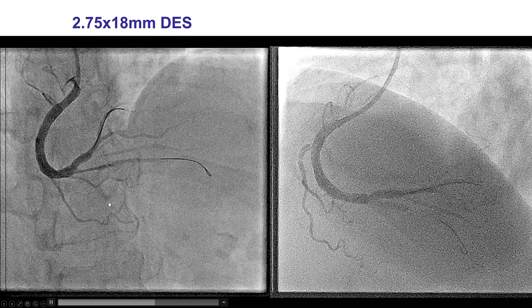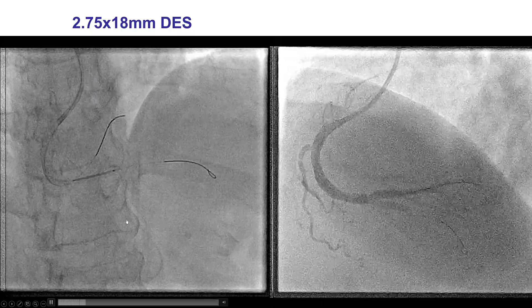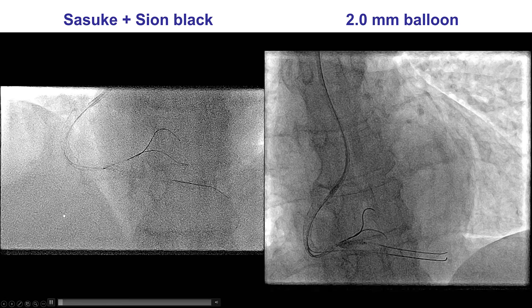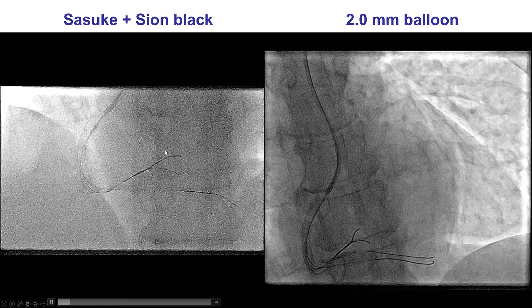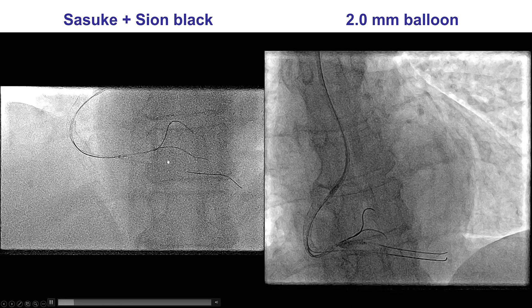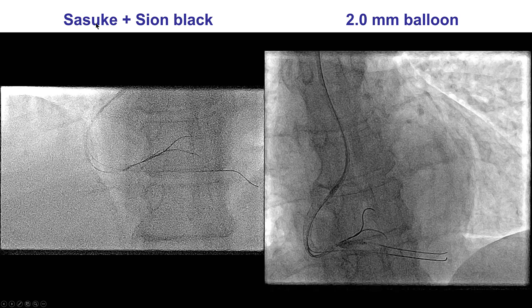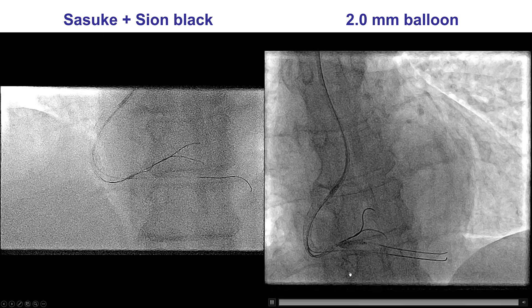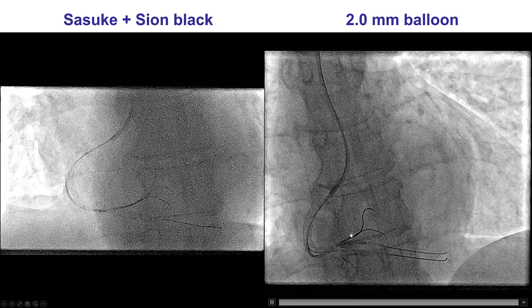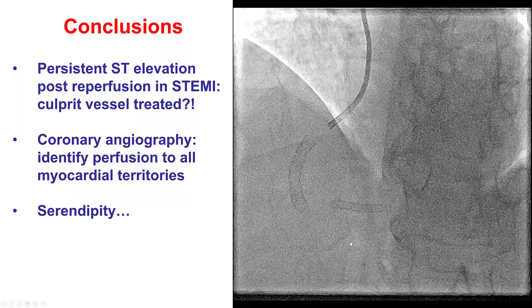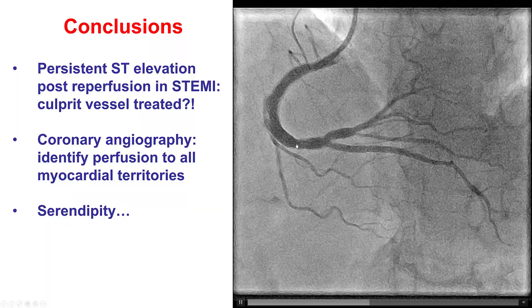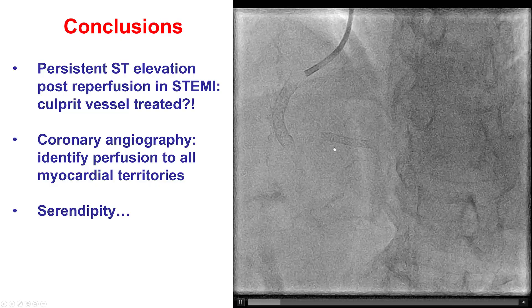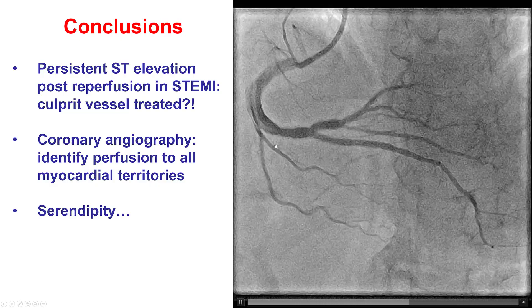We placed a drug-eluting stent across the origin of the posterior descending artery, and then we were able to wire with difficulty the right posterior lateral branch using a dual-lumen microcatheter — a Sasuke — and then performed balloon dilatation with a 2.0 mm balloon. That provided a nice final result with TIMI flow in both the PDA as well as the right posterior lateral branch.